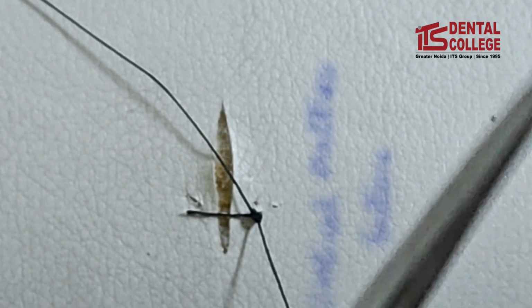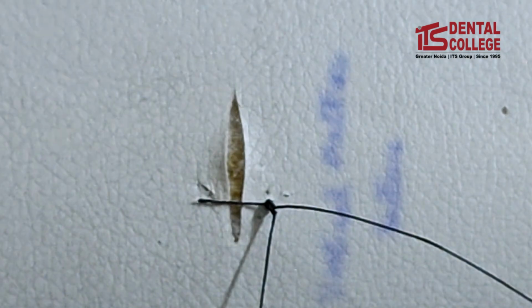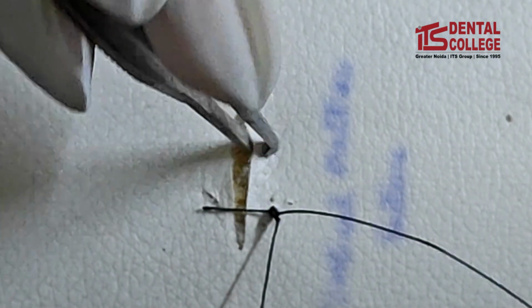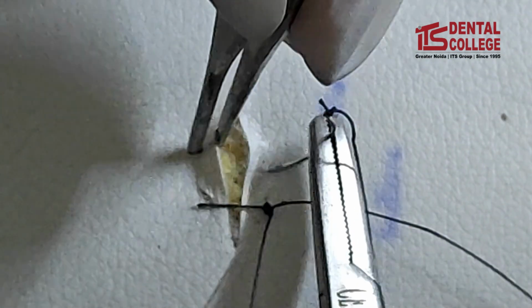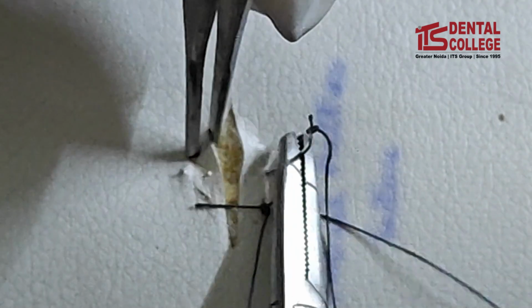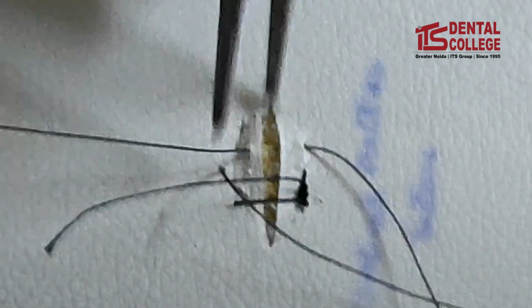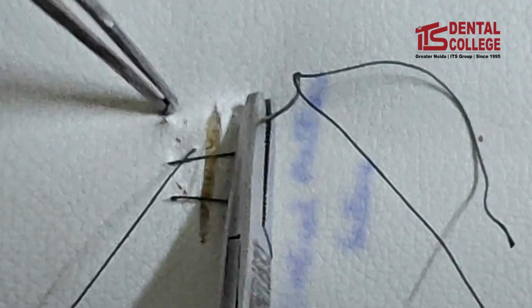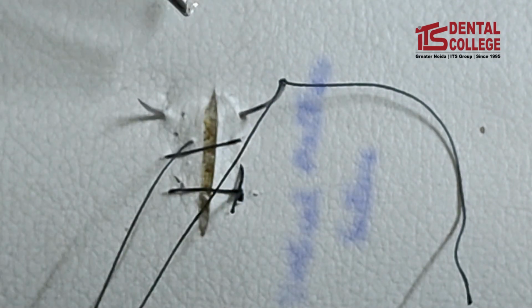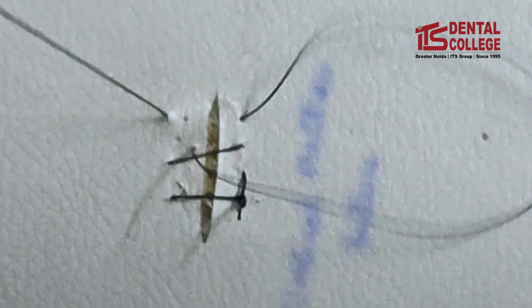Then here, instead of cutting the suture, we will continue this in a continuous fashion. So this can be used when we have a long incision, for example in alveoloplasty cases. So again, continuing with the same one, we will take again one more bite from the buccal and palatal, continuing it over to the palatal aspect, and similarly the whole incision can be closed in this manner.